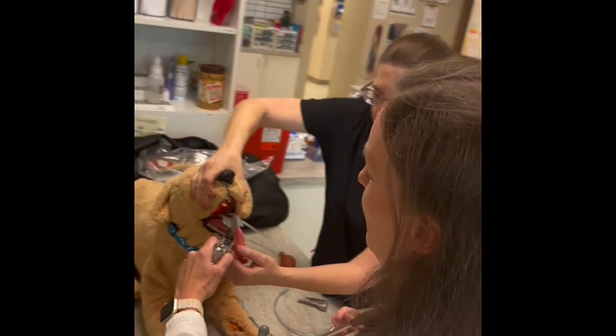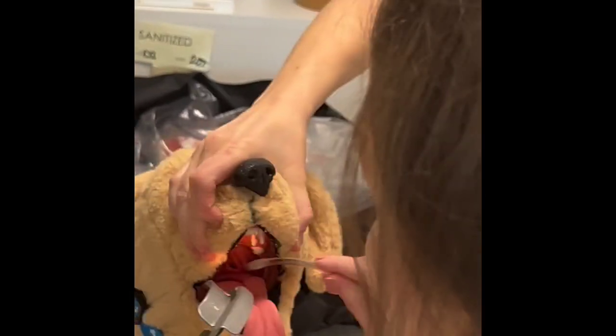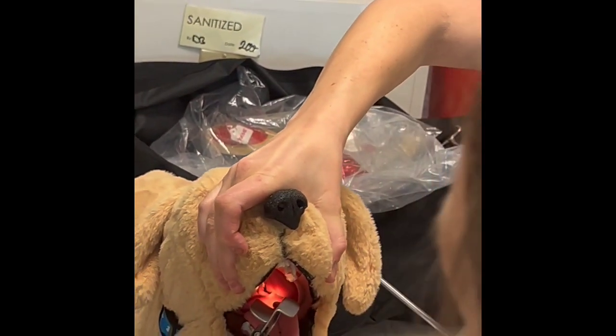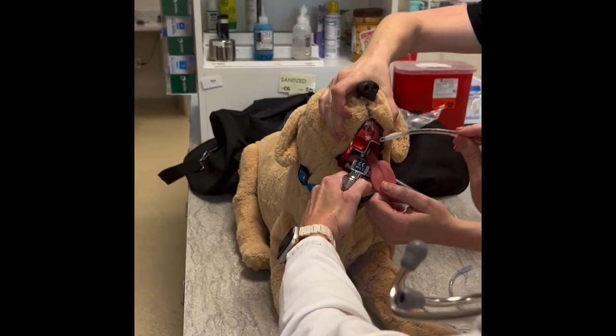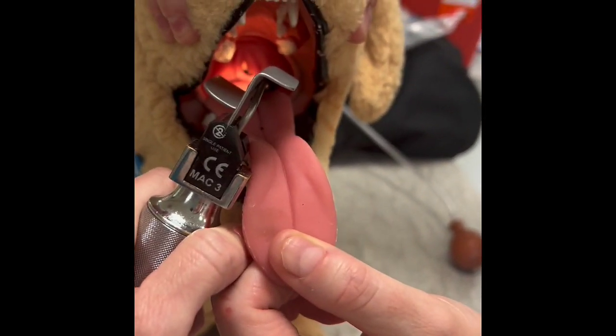When you look at the anatomy back here, you don't want to touch the epiglottis — that flap back there — because it can be irritating. You actually just push down the very back of the tongue, which is going to open everything up. Then you can see the hole back there between the vocal cords and up top the arytenoids — right in the middle there.